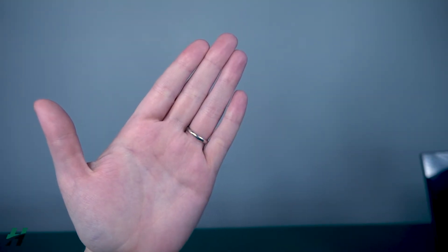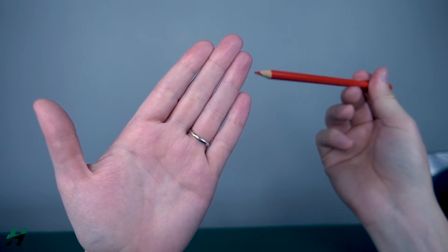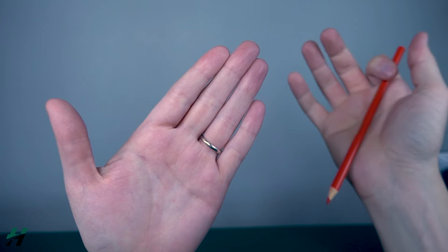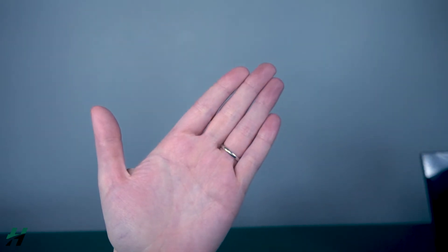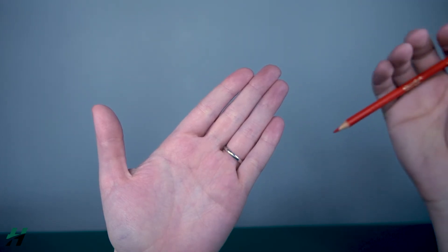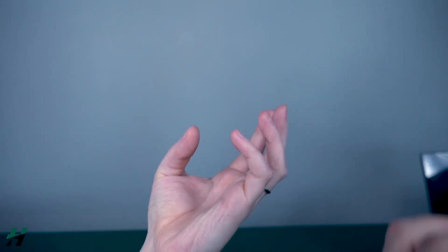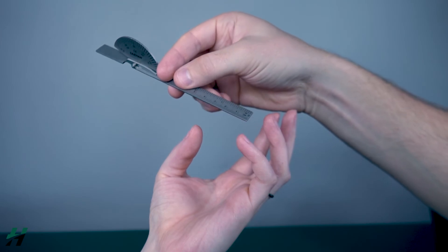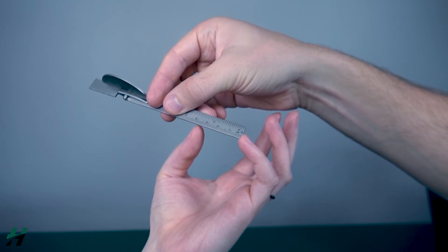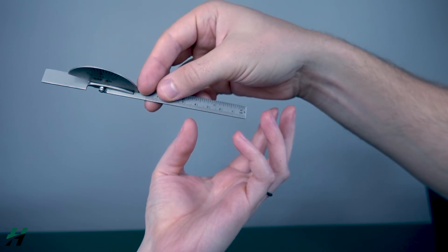Measuring thumb opposition. The patient will be in a seated position, elbow on the table, hand in the air. The goal is to find the distance between the tips of the fingers and the tip of the thumb. Rachel, touch all your fingers to your thumb — this would be seen as having no deficits. Now if there is a deficit, grab your goniometer and measure the distance between the two fingers in millimeters or centimeters. Here I'm looking at about 38 millimeters. Do the same measurement for all of the fingers.